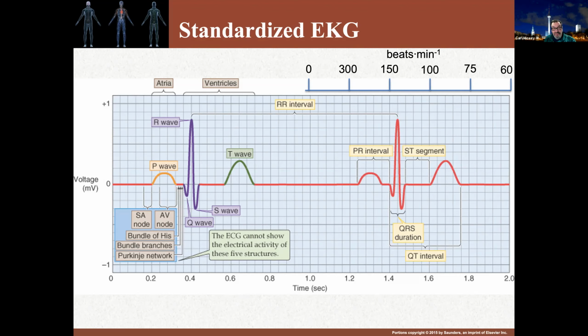The T wave, which is the wave which follows the QRS, here's the T wave, is a small, rounded, generally upright wave. And this is an indication of ventricular repolarization. Once the ventricles have fully repolarized, then they're ready for the next cardiac cycle.